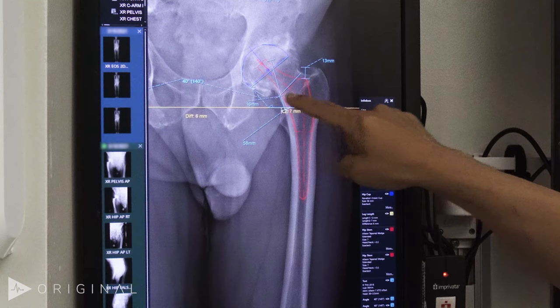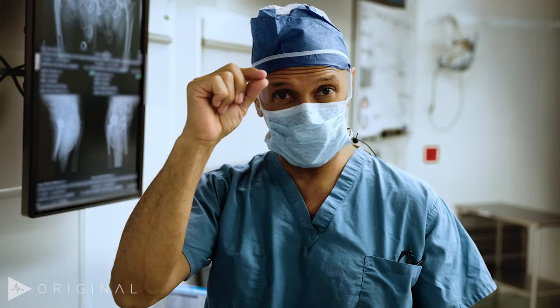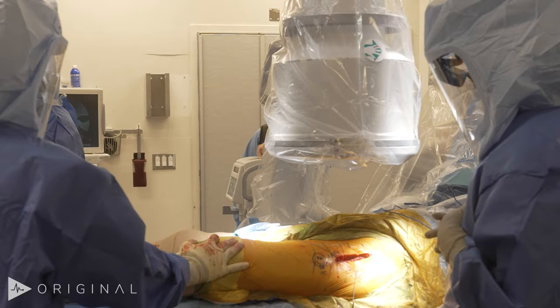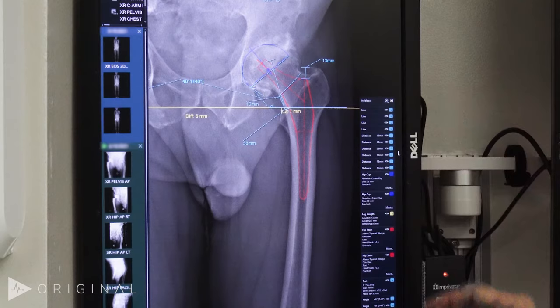We set the center of rotation. This patient has a left extremity which is three millimeters shorter than the right because of the loss of the cartilage space, and so we seek to restore that. We will measure that during surgery both radiographically as well as clinically by measuring the legs in the same manner that we would if he were in the office.